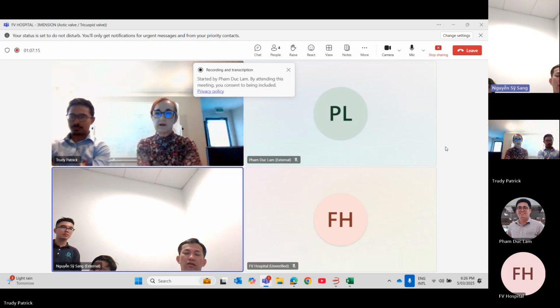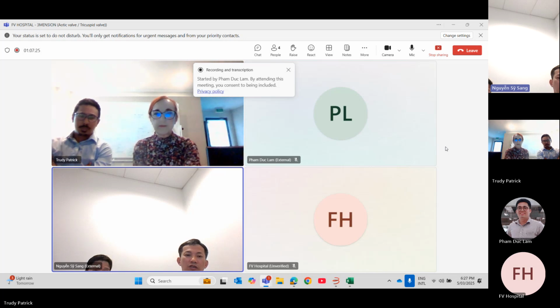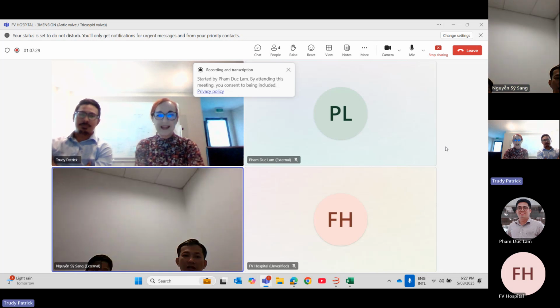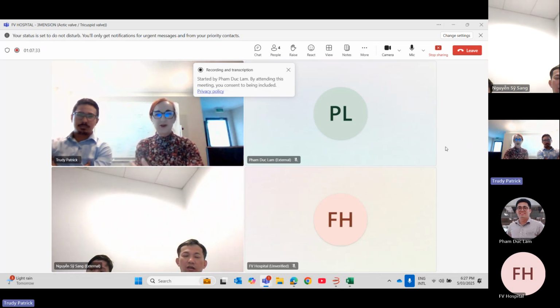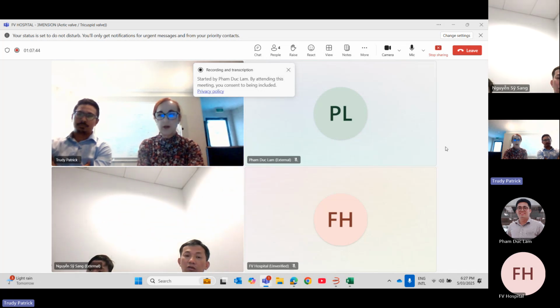I think that's very clear. So we can also go to report some cases and then maybe some more questions later. Yeah. We need to practice first and then yeah. It is a lot of information to take in on the first view of it. So yeah, have a play, and we are here to help you. So send through any questions or anything at all, and we can help you.